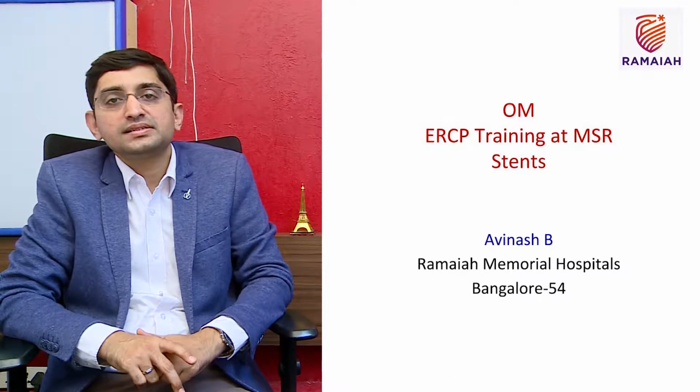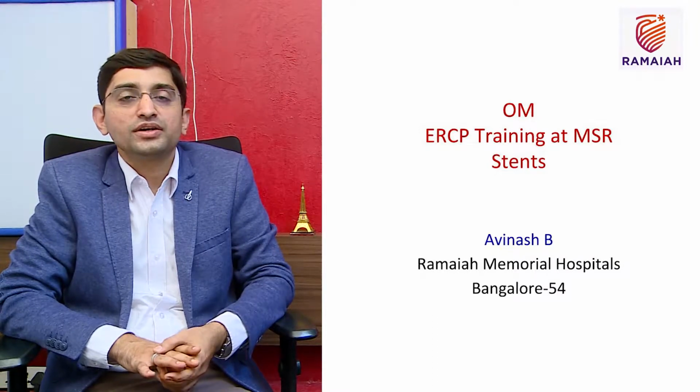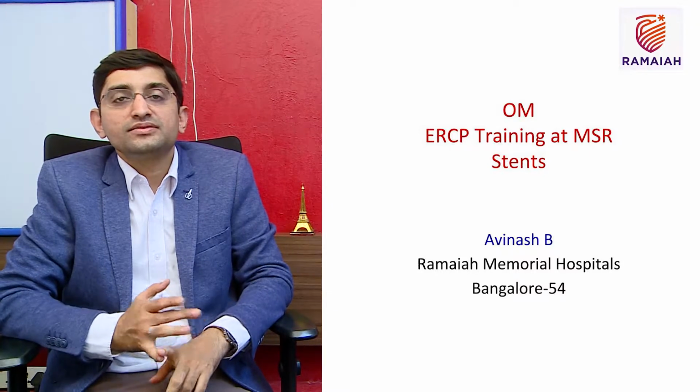So this deals with cholangiography. How are you going to interpret the different cholangiograms? How are you going to stent? So we have covered disinfection, sphincterotomy, balloon, as well as the guide wires, baskets. So we are going to look at how to interpret the cholangiogram, as well as the different types of stents that we are going to use.